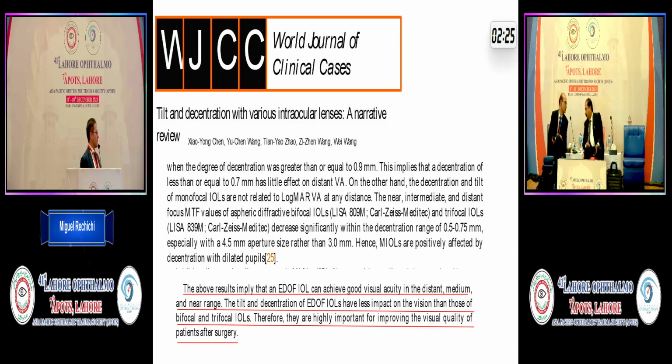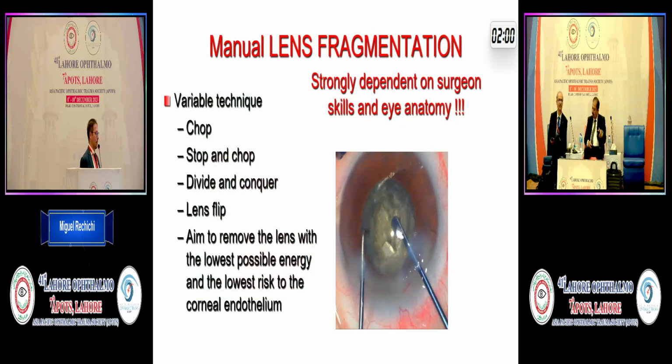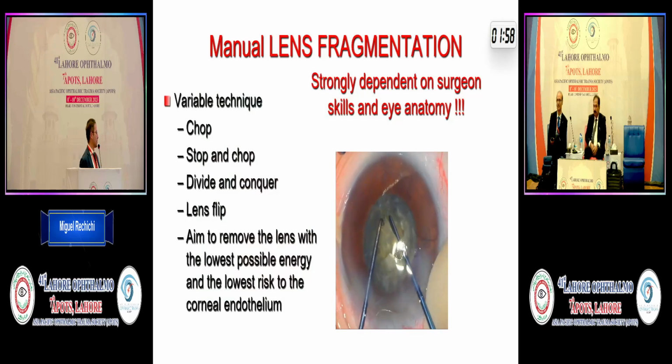Especially if we put premium IOLs in a very long eye, in these cases the femtosecond laser really will help us reach the best refractive results. And there is also some priceless evidence, not published, that we can observe at the slit lamp when we see our patients after time.